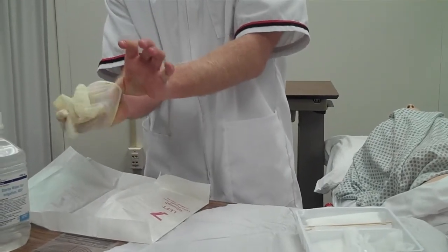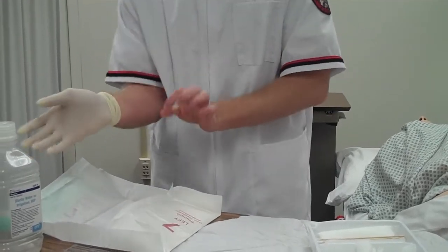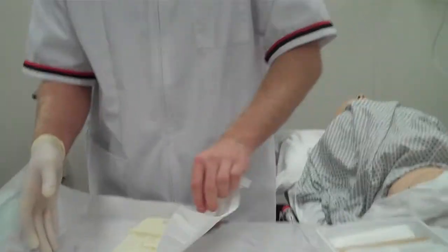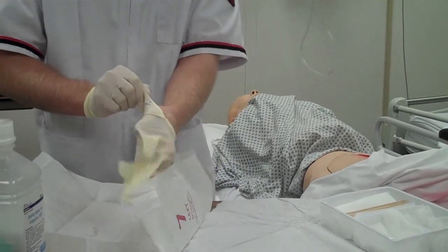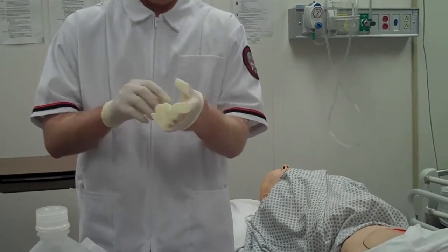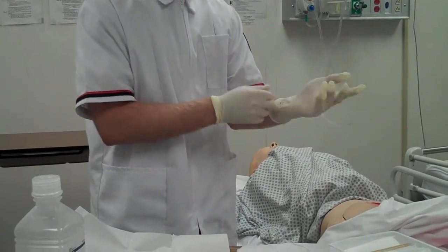Make sure I don't touch the outside of it, with my thumb on the inside. And then I'm going to pull this in. Make sure I touch the inside. And I can touch that.